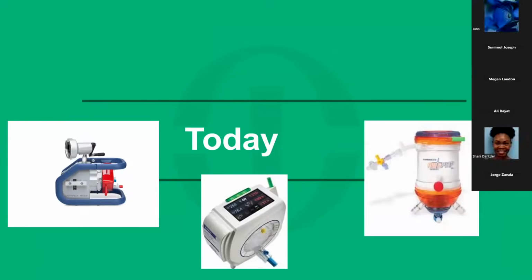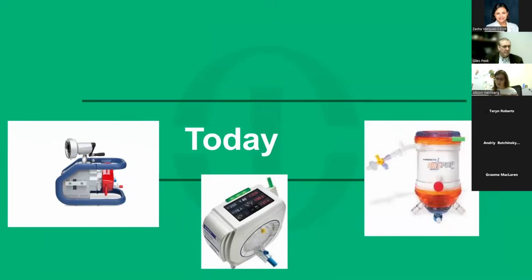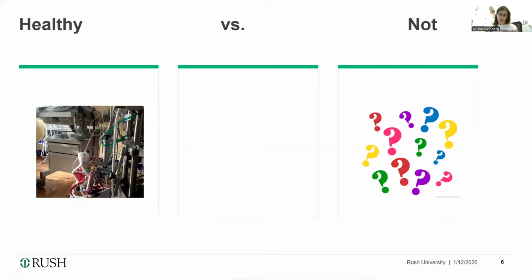Today we have other choices, and I have no doubt there will be more to come. But today we're going to focus on how to recognize what we have and how to handle the cards that we're dealt. Really, how to come together and make a consortium to move forward together to make a better tomorrow. All right, so we all know what a healthy oxygenator looks like.